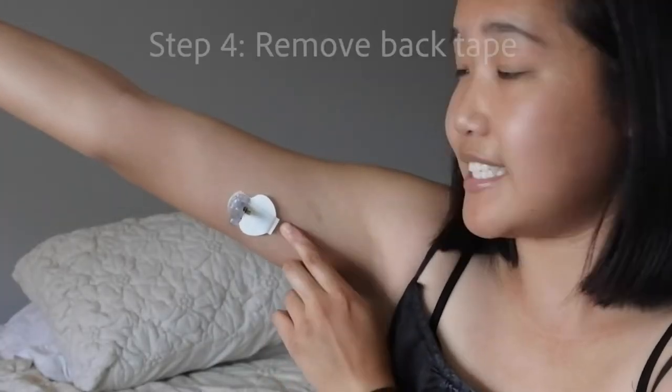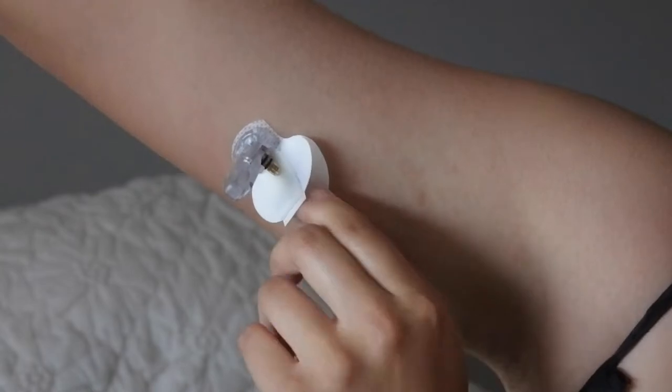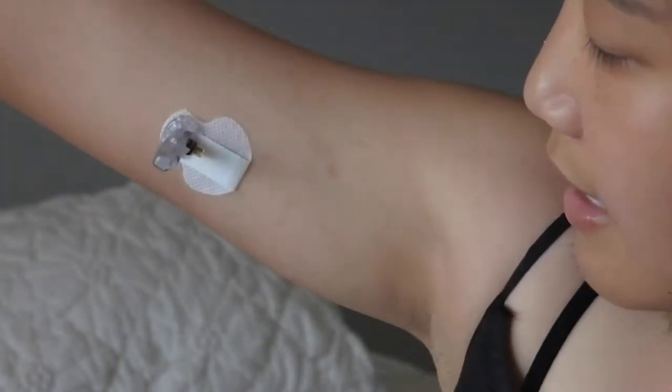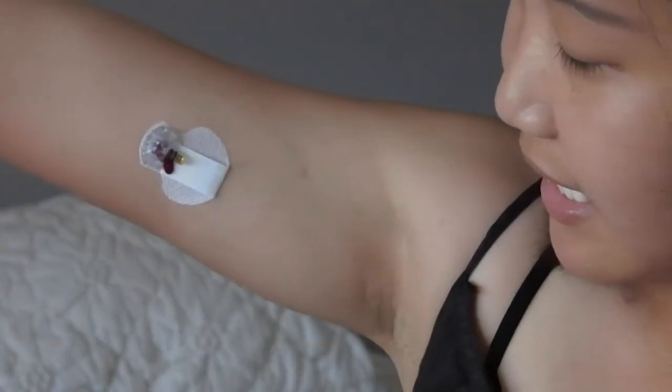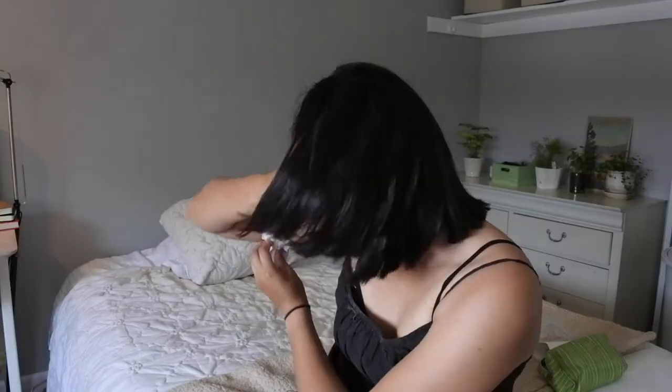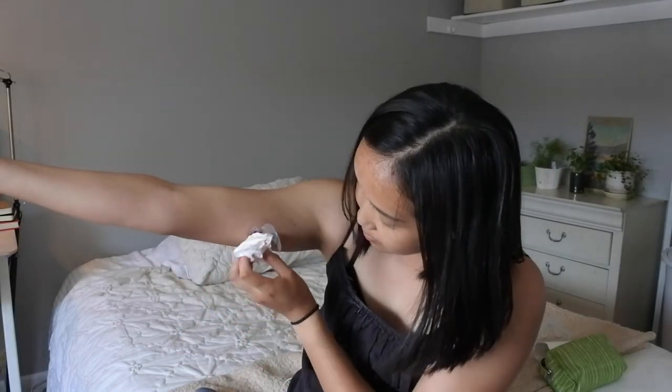Next, I take down this first piece of tape, then remove the needle piece. Mine is actually bleeding right now, which is not ideal. So if your sensor starts bleeding, just hold it and apply pressure for a couple of minutes — it doesn't stop the sensor from working in my experience. It's still a good sensor; I just want it to stop bleeding before I proceed.